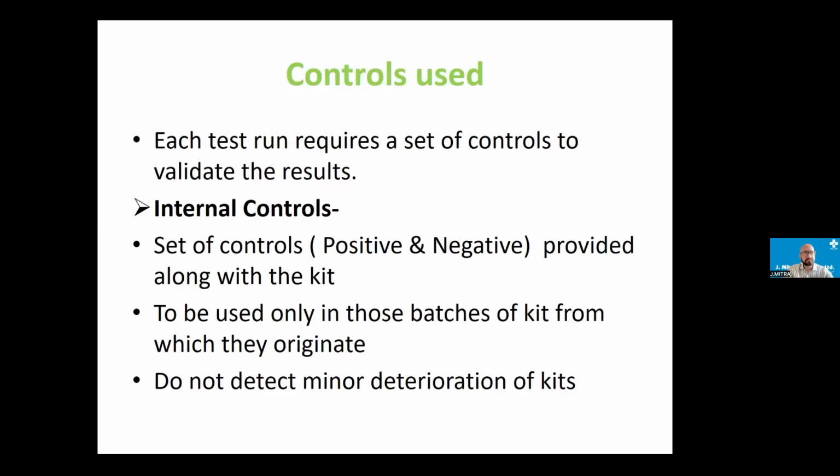Actually, it does not require any special setup. Likewise, in ELISA, you need a simple refrigerator. We have all the 4-degree refrigerators in our blood banks. So you can keep your reagents in that refrigerator, and you have to follow the manufacturer's instructions. Some reagents are advised to be kept in a minus 20-degree freezer, some in a 4-degree freezer, and some at room temperature. So you don't need any specialized freezer or storage system for CLIA to run. If you have the ELISA setup, you can easily install a CLIA machine.